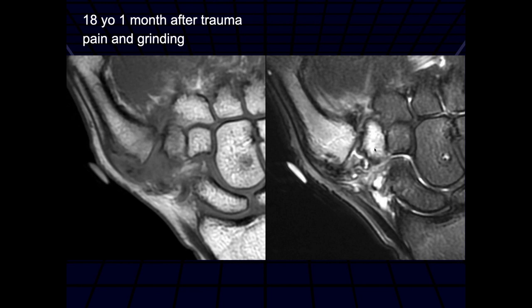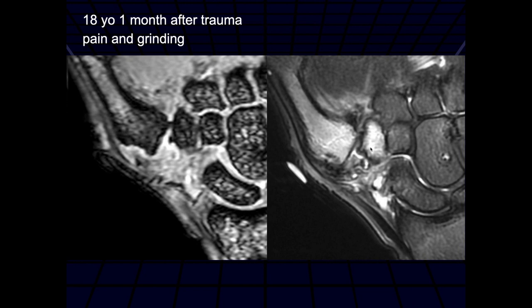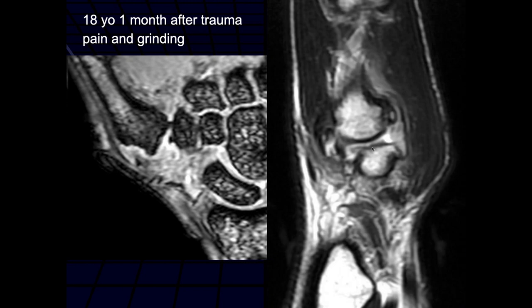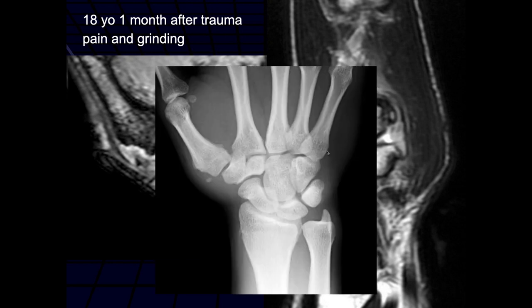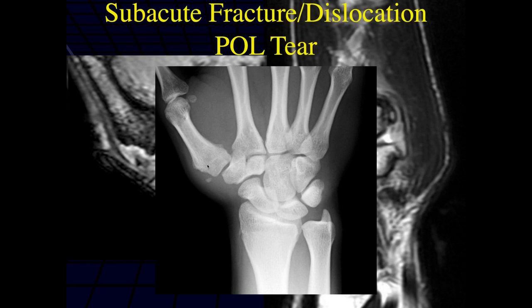18-year-old, one month after trauma, pain and grinding at the CMC joint. We're seeing a lot of edema and irregularity of the capsule, particularly the posterior capsule, with edema in the base of the metacarpal and the trapezium with some radial displacement of the first metacarpal. There's more irregularity on the posterior side — maybe a complete tear of the posterior oblique — and there's a small bony fragment there that looks well-ossified, so maybe it's pretty chronic.